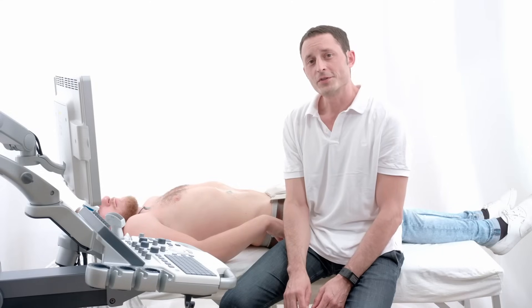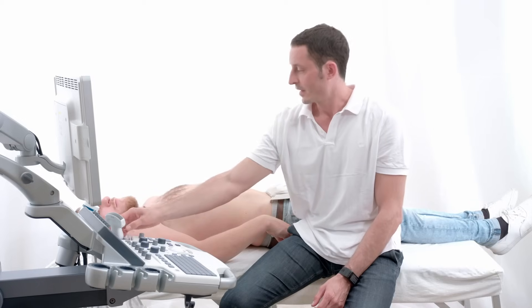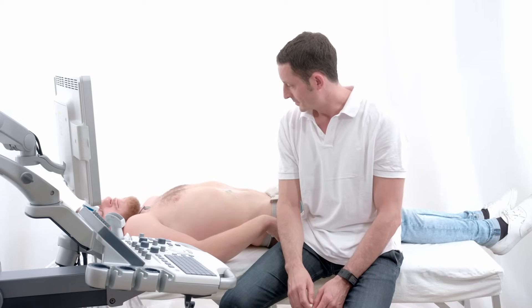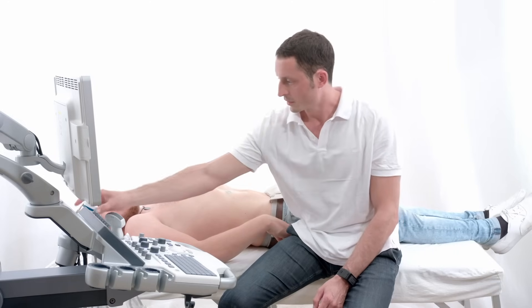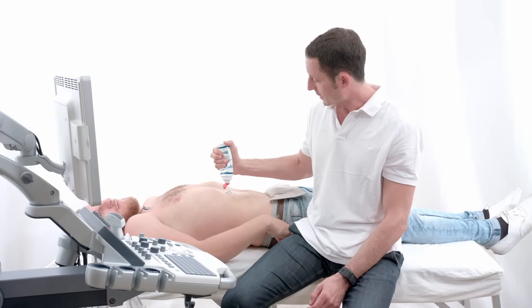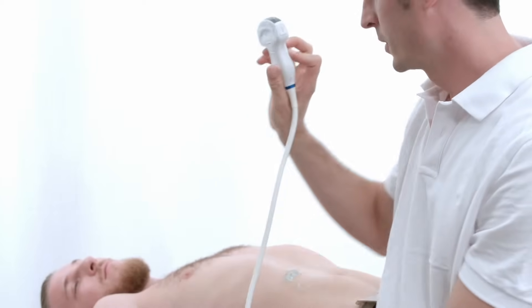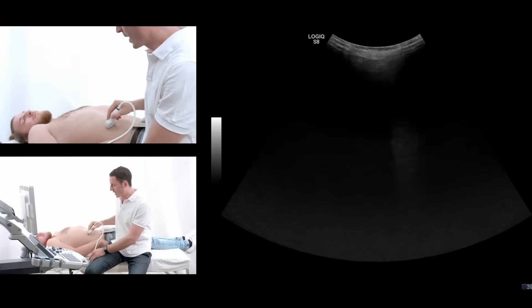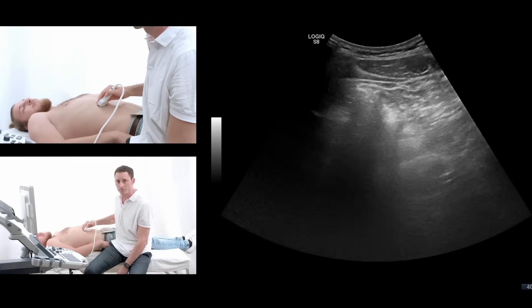I'm going to show you the standard ultrasound evaluation of the liver. For that I will ask the patient if he has eaten. I ate two hours ago. I will use some ultrasound gel on the right epigastrium and use the curved array sonographical probe. The standard abdominal pre-settings of your sonographical machine will be sufficient.